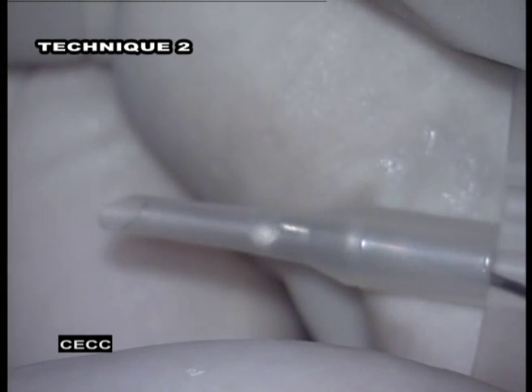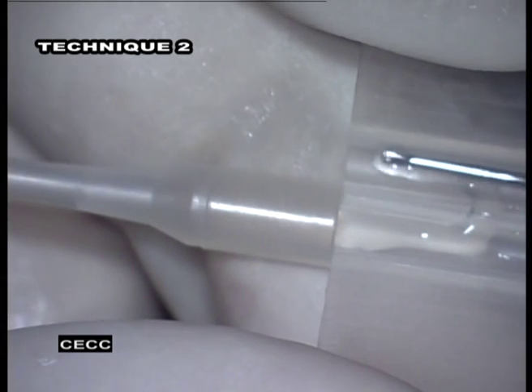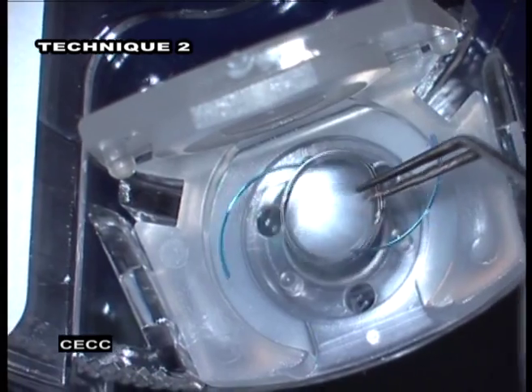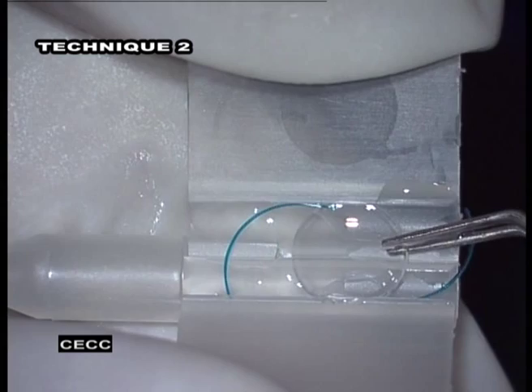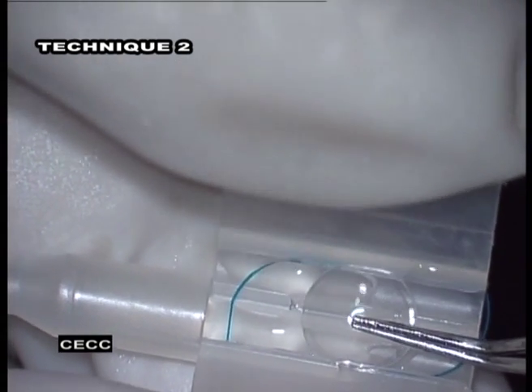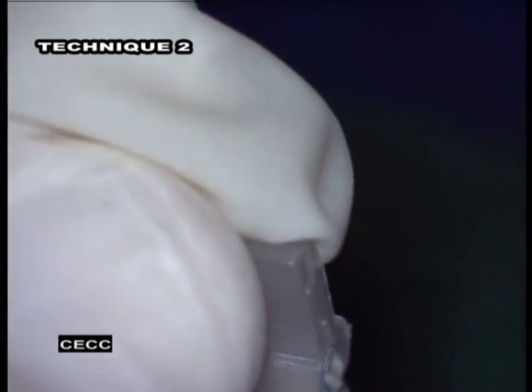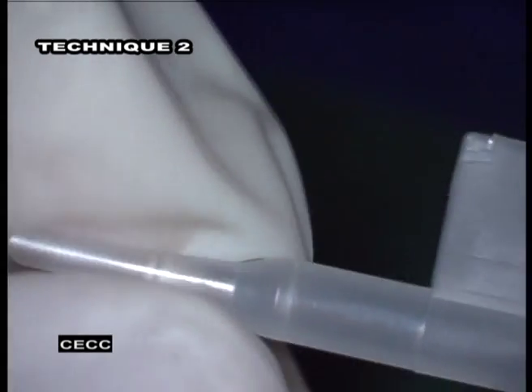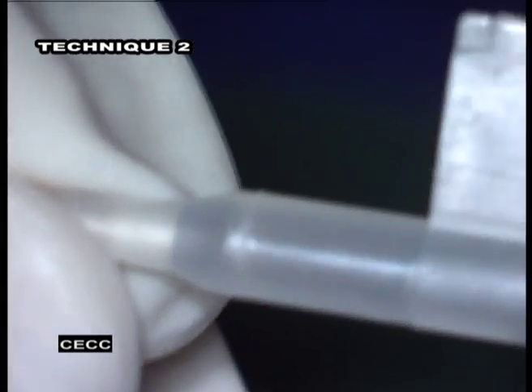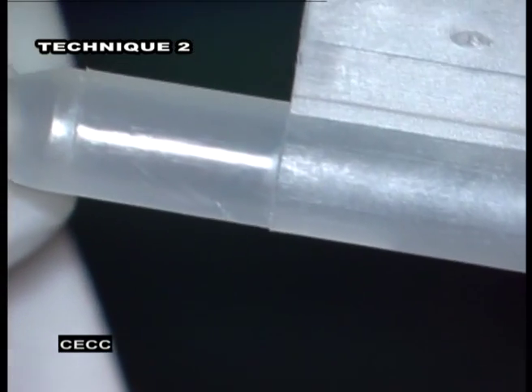In an alternative technique, the IOL can be loaded onto the cartridge from its rear aspect. OVD is applied to the cartridge as usual. Using McPherson forceps, push the IOL forward into the hinge portion of the cartridge. Make sure the edges of the IOL are held below the ledges of the wings. Close the wings and ensure that the leading and trailing haptics are in the right positions as described before.